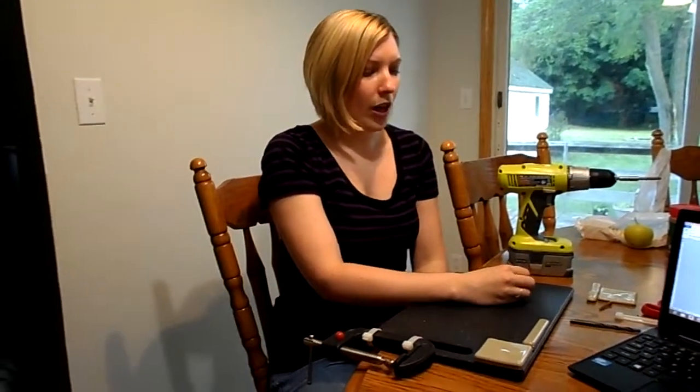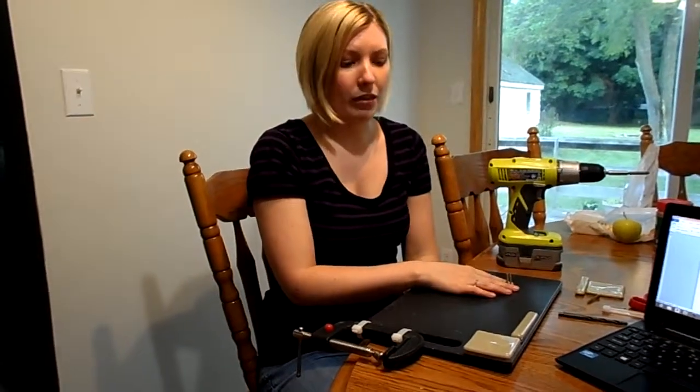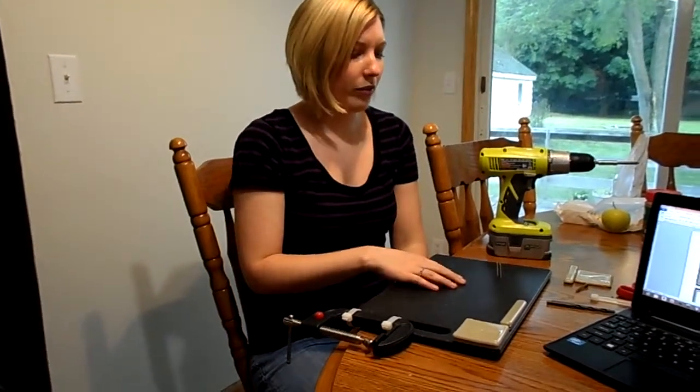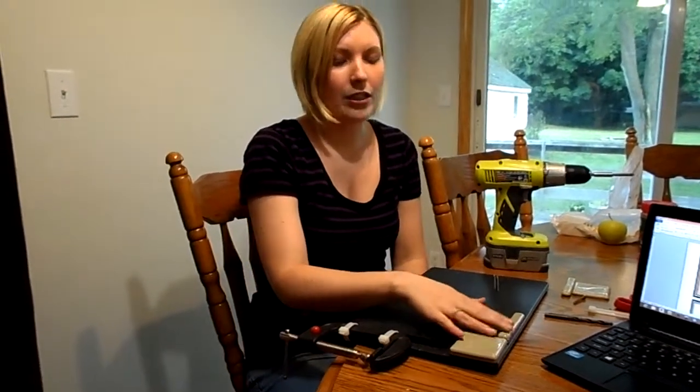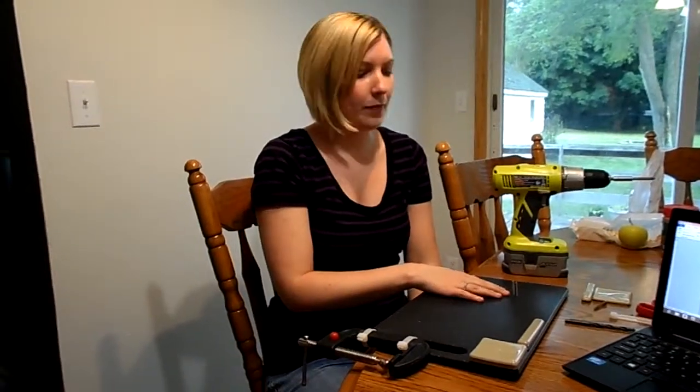The sharp objects here will stabilize the food and also provide some tactile input, or a way for somebody with visual impairments to touch and feel where their food is.